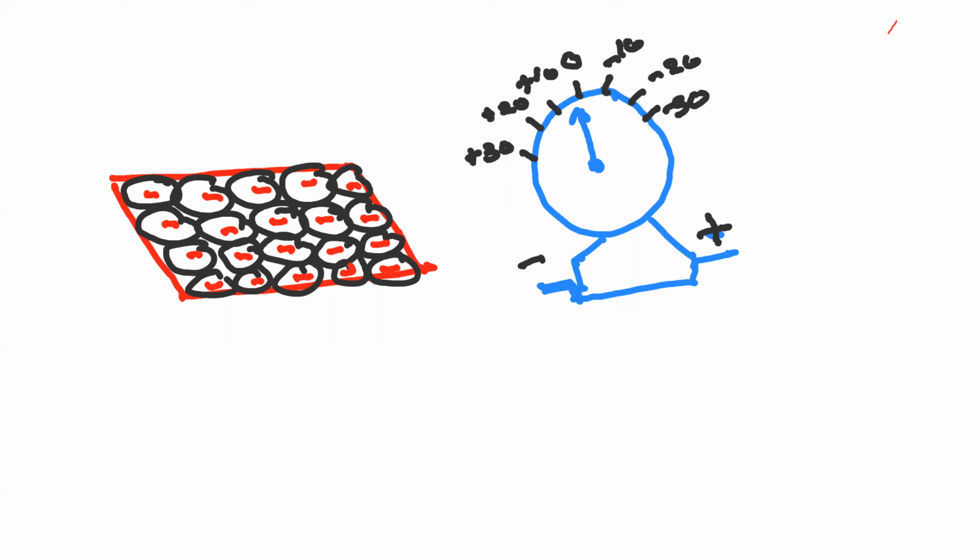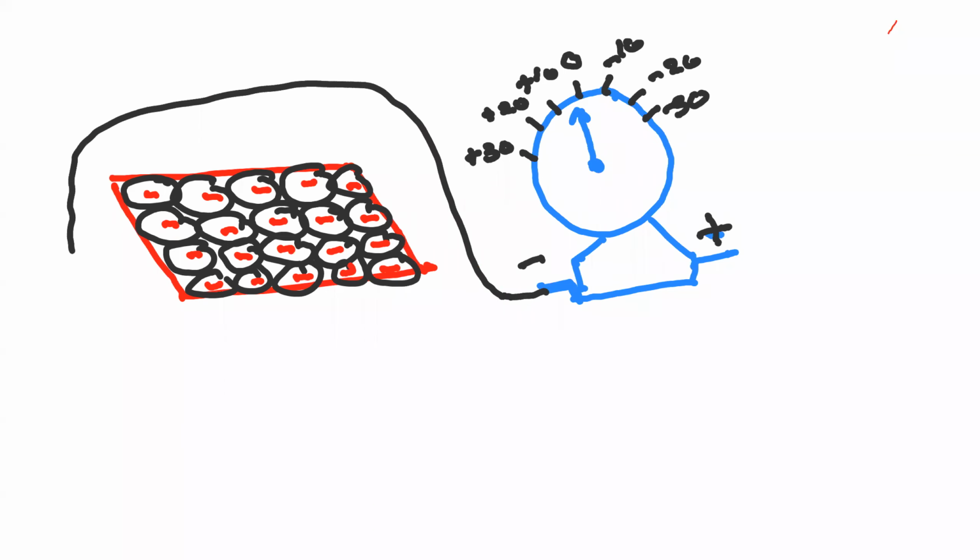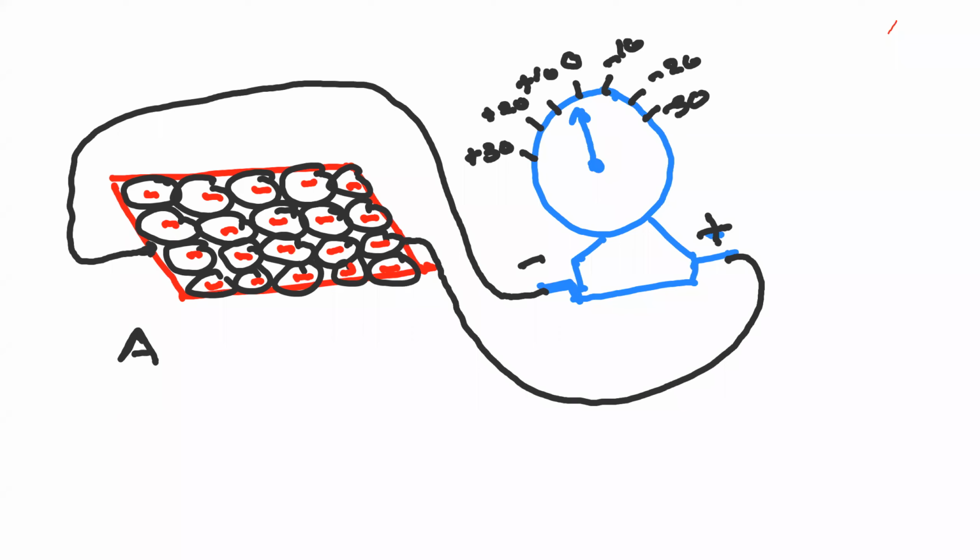So now I connect one of the ends to this area. This is A, and this electrode connects to here, B. Clear නේද? මම කරපු දේ ඔයාලට තේරුණානේ? Right. Now what happened? Is there any electric activity? No. The heart is in the resting membrane potential. There is no electric activity.